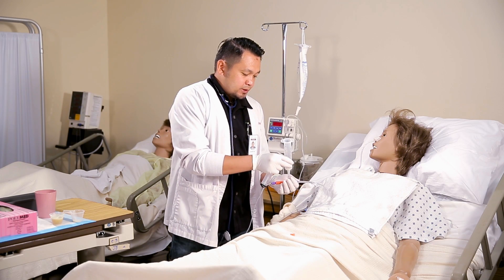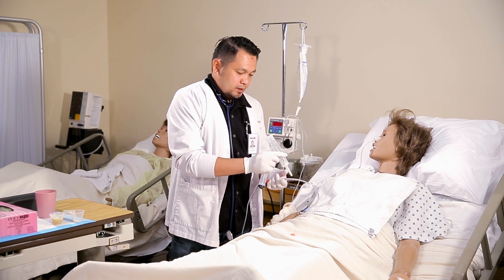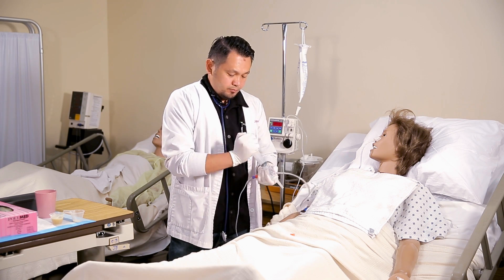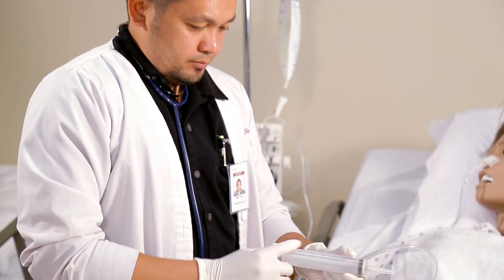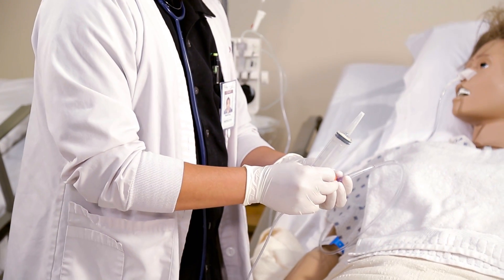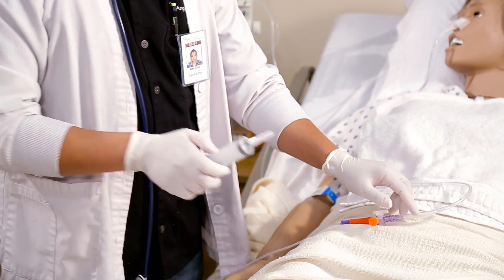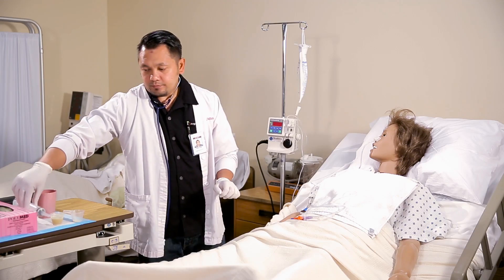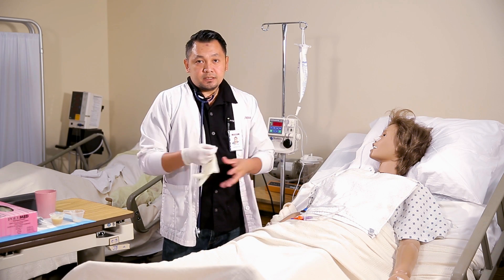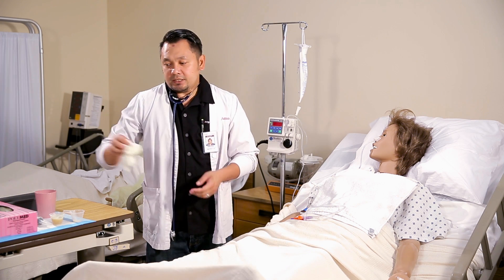Then we remove the syringe and replace our plunger back in. Take off the gloves and perform our hand hygiene.